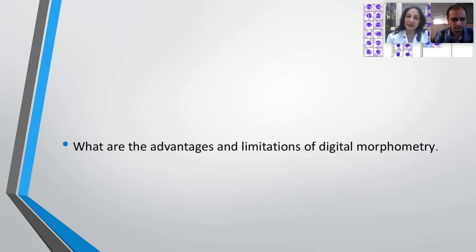Platelet clumps, although the sensitivity is pretty good, but still you end up doing a manual review. Then the platelet population, I think, still needs some work, where we still have to review. Our criteria have not improved too much when it comes to platelet population in the review. And also whenever there is a penia sample, though WBC and abnormal cells are suspected, although you will rely on digital, manual microscopy is definitely not ruled out in such scenarios. Right. So these are a few insights on the validation that we've been doing, and this was our outcome.